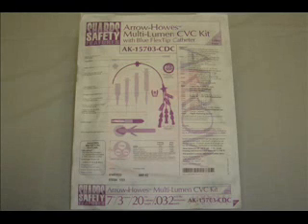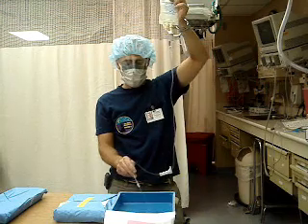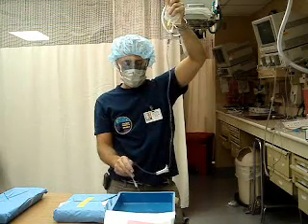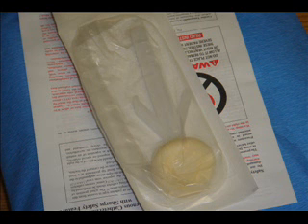Before you get sterile and grab that needle, take the kit out of its container, place it on a mayo stand, and open it up — be careful not to touch what's inside. Get your flush and empty it out into either the container itself or a basin, whichever you picked. After the flush is ready, now it's time to prep and clean the patient. Grab whatever you're using to clean and clean off a good square foot or two area on the patient so you don't have to worry about hitting an unsterile area of the skin.